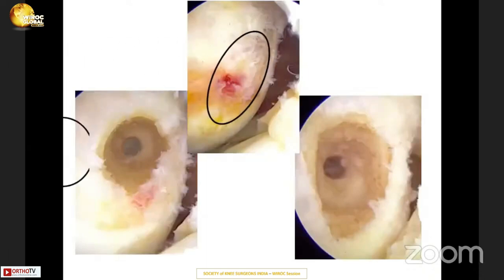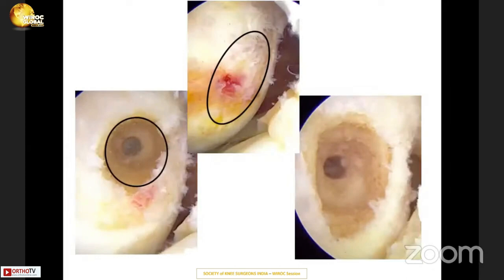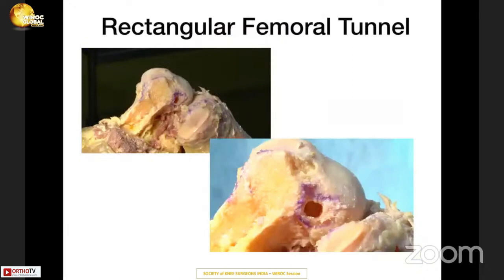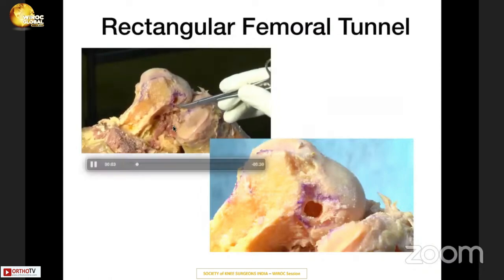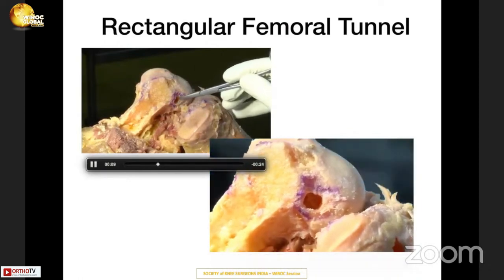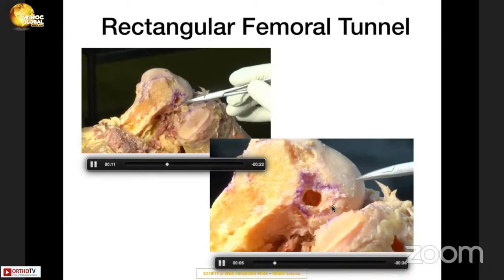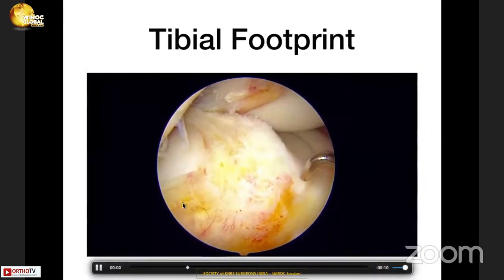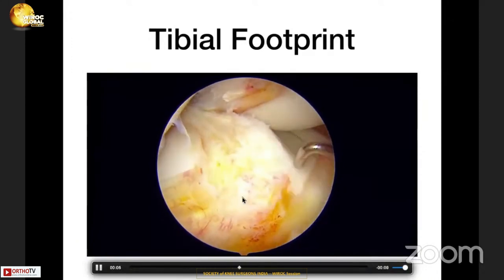This is the original native ACL footprint. This is what we create with a circular tunnel in anatomical ACL reconstruction. And this is what my new technique with a rectangular tunnel dilator achieves — a near-normal native ACL footprint. I have also demonstrated this on cadaver. On the tibial side, we also know that the footprint is not circular — it's somewhat rectangular in shape and quite large.